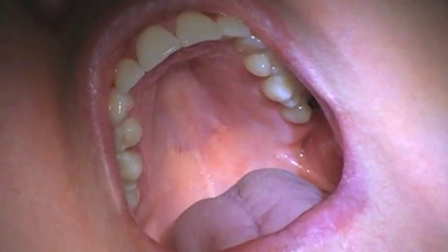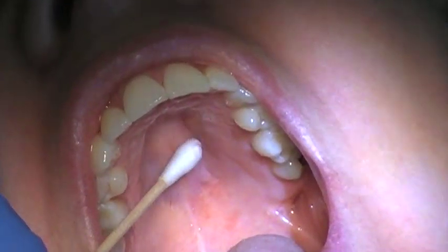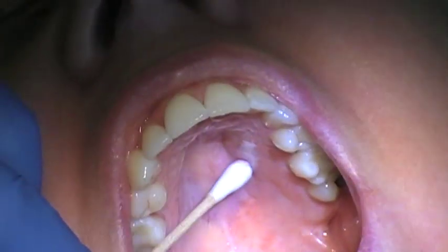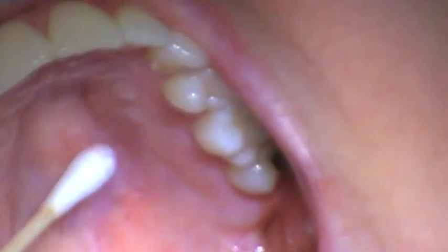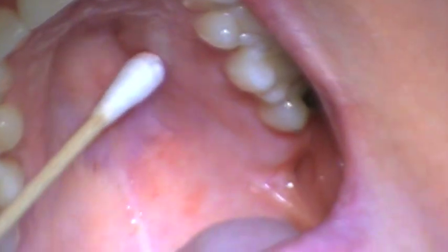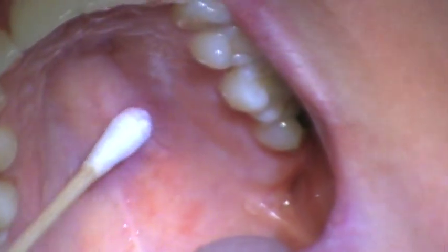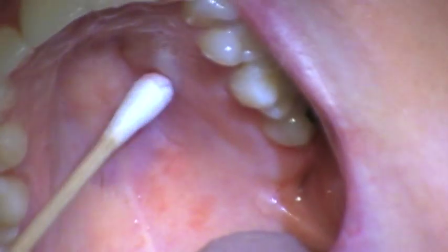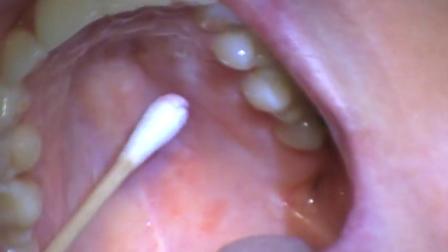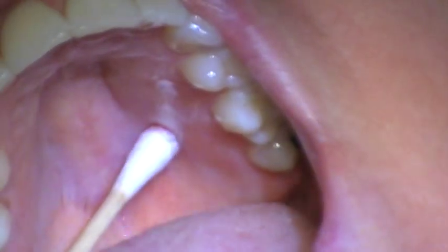We're going to do the GP injection today. The syringe is ready in my right hand and I'm palpating starting from the first molar area. The location is going to be where the vertical and the horizontal planes of the palate meet. I'm just going to start feeling back until I feel a springy spot — and there it is, it's a little springier right there.